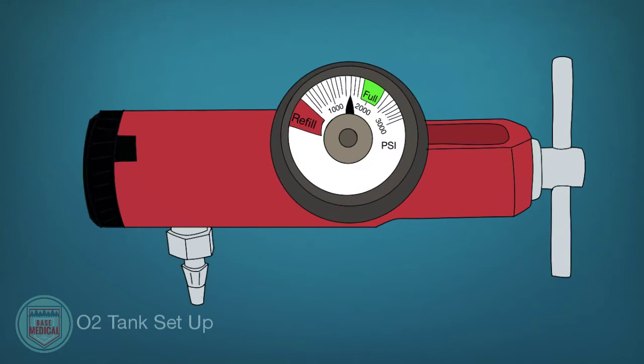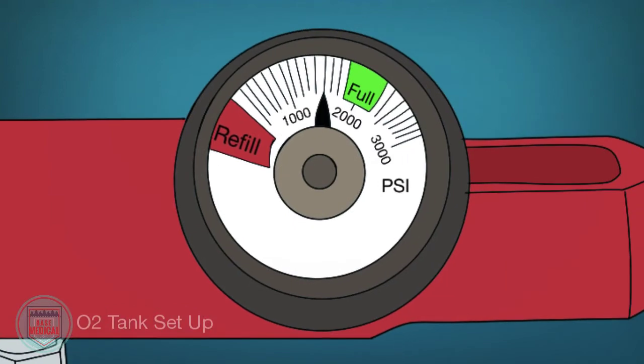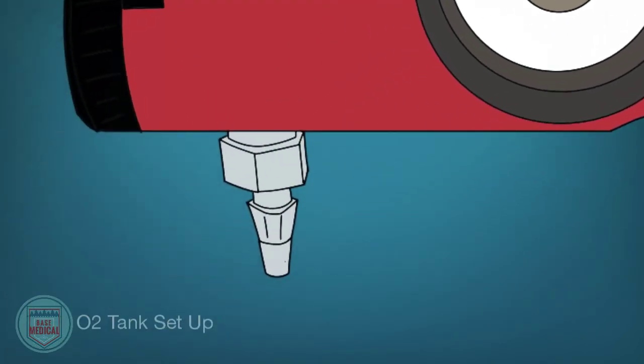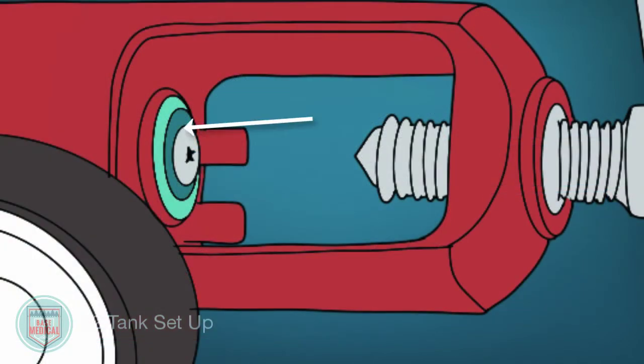The regulator allows you to control the flow of oxygen coming from the bottle, measured in liters per minute. Different oxygen delivery devices require different flow rates. The regulator also shows you the pressure within the tank and manages the pressure coming out, as otherwise it would be too great to use on the patient and potentially dangerous. Be sure the regulator has an O2 ring or gasket — this creates a seal between the regulator and the tank. Without it, oxygen will leak.